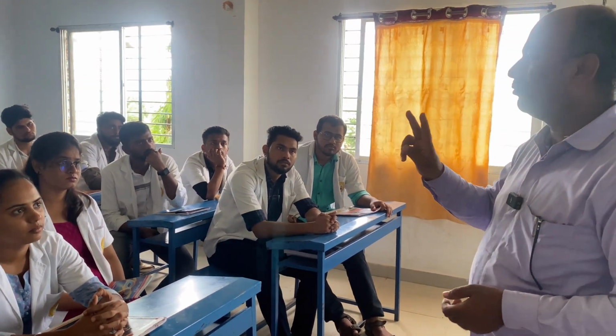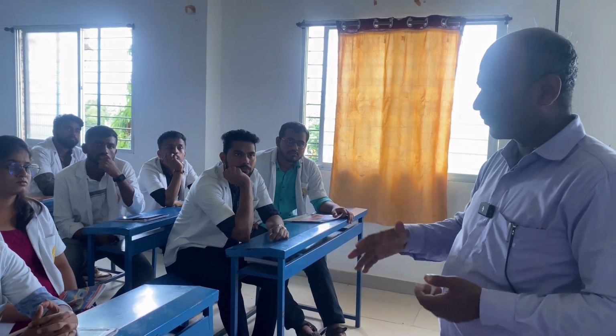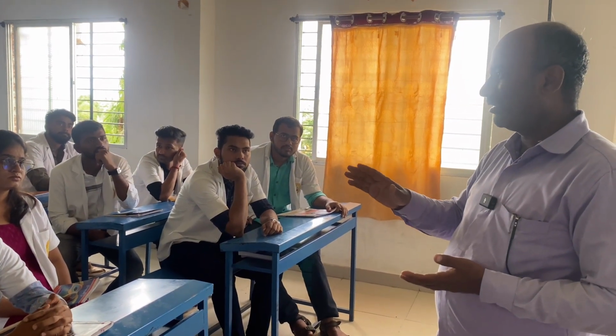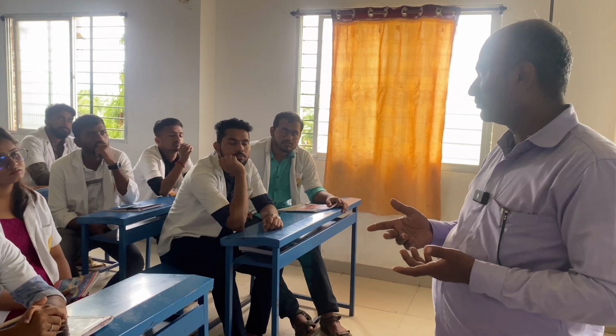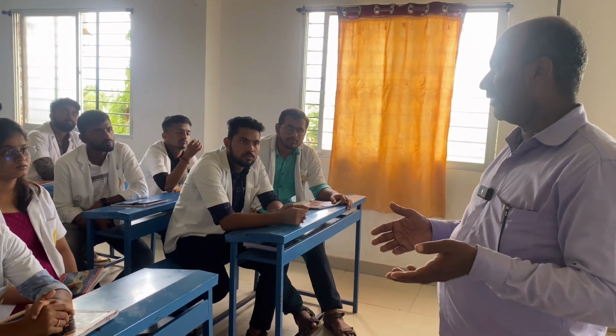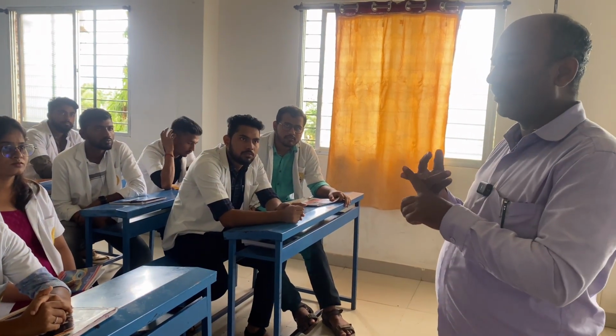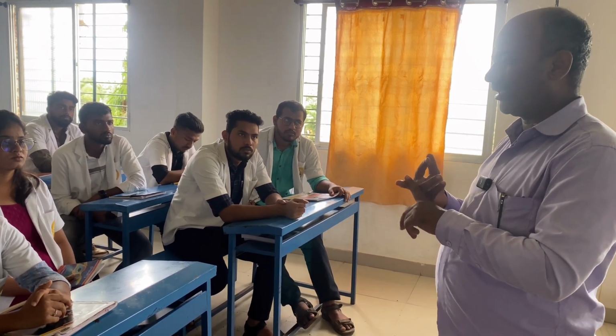So there are only two clinical points which we identify with direct distance ophthalmoscopy. Number one is the quantity of vision based on the quality of the glow, and if the glow is very pale, pale means the red becomes white, then there is no vision at all. When you see through the ophthalmoscope a white spot which was expectedly a red spot, that is called white pupil. White pupil is indicative of two diseases, retinoblastoma and senile hypermature cataract.